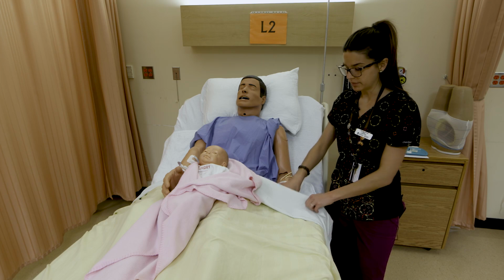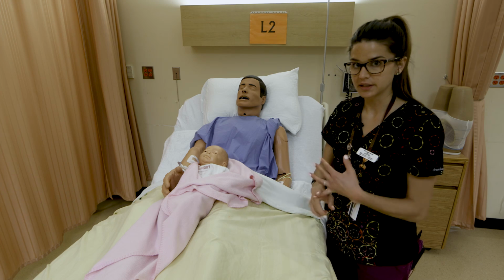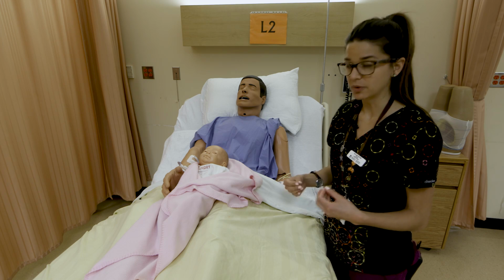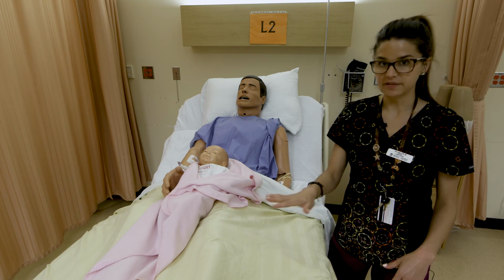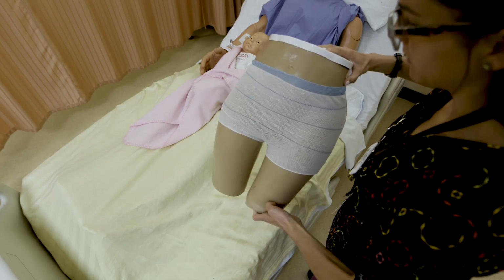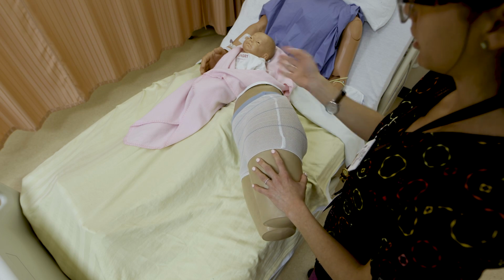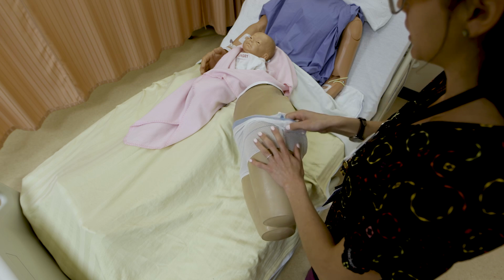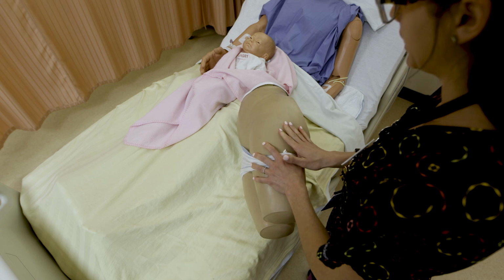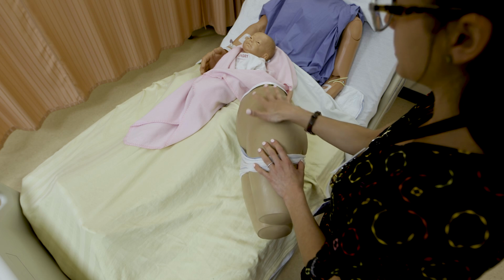And finally, the third site that we talk about and practice, and it's actually the preferred site because it can hold the most amount of medication, is the ventrogluteal site. It's the biggest, thickest muscle, and it's well developed in most people. This is a model of a pelvis for demonstration, and we'll just tip it on its side. Just like with a patient, you would ask them to lay on one side, and then you'd want to remove their pants and underwear to get to the site. For landmarking, you're going to use the palm of your hand and place it right on top of their greater trochanter.